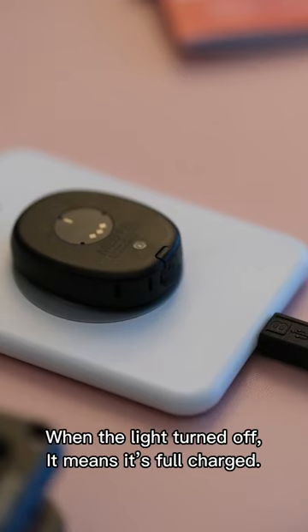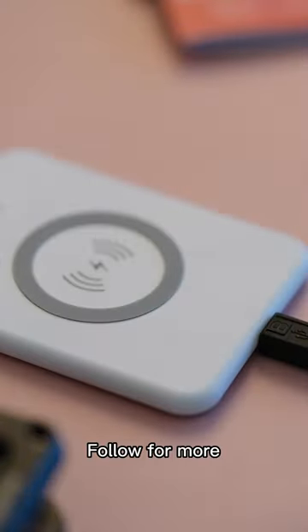When the light turns off, it means it's fully charged. Follow for more.